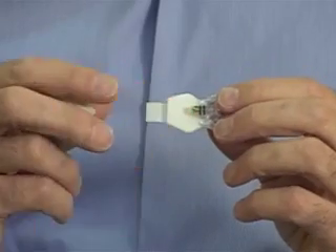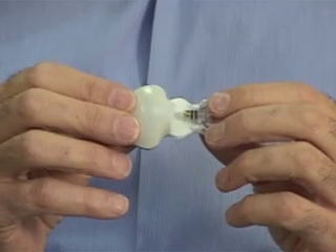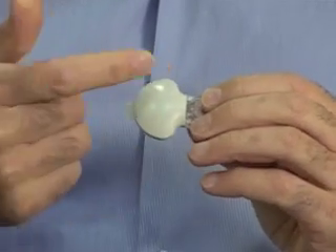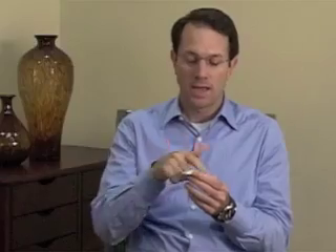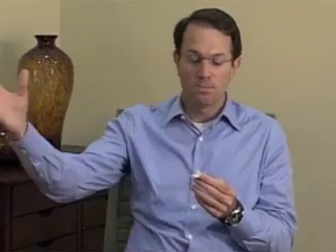Once the glucose sensor is placed underneath the skin, it must be connected to the transmitter device — the MiniLink. Once connected, the sensor is physically linked to the transmitter. Inside this device are the electronics that operate the sensor and measure the signal created by detecting glucose in the body. A transmitting element then transmits the data every five minutes to our pump or the Guardian monitor.